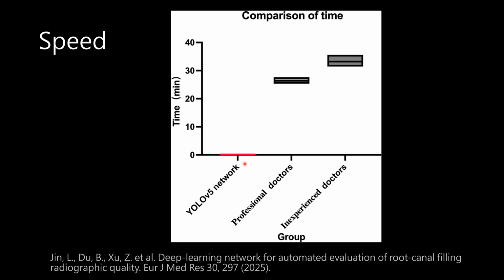Of course the AI is very fast. It can diagnose whether the root canal filling is fine, is correct, very fast. And a doctor needs time, right? Of course, they are computers. They compute very fast.